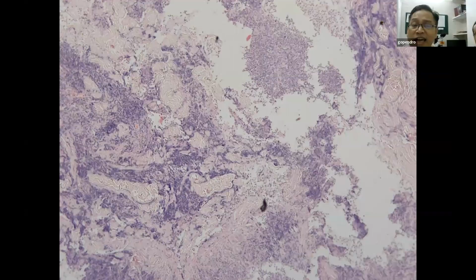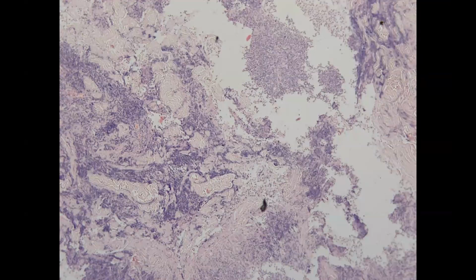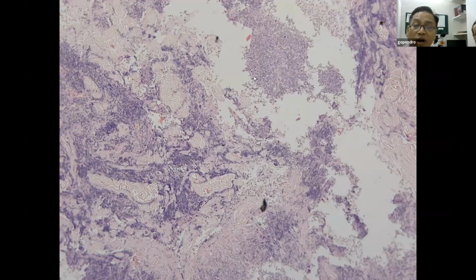Subsequently, a biopsy was done from that area. In our department, we received a piece around 1.5 by 1 centimeter, skin covered, and the biopsy shows diffuse infiltration of lymphoid cells. The upper part of the biopsy, that is the epidermis, was normal. There was no infiltration of these lymphoid cells there. In other words, there's no epidermotropism.